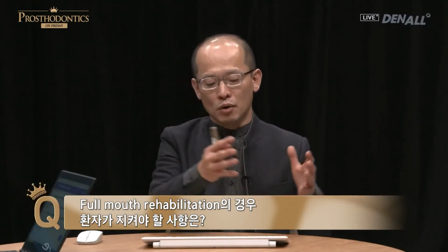It should be in short intervals, and patient needs to be recalled many times. So slow by slow. So overall, it requires a few months, 2 or 3 months. So I usually recall the patient every week. And there you don't do a lot of occlusal adjustment.